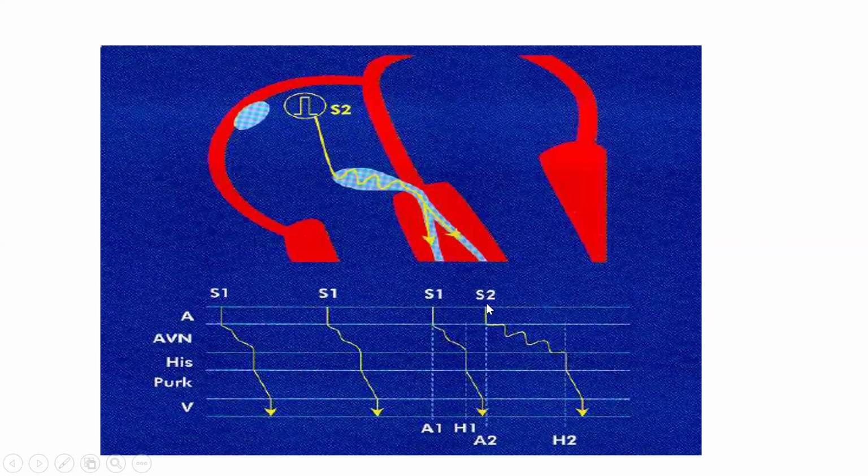And anytime they shift to a shorter duration of pacing, you call it A2, H2. If there is a V, V2. We're just trying to say use that terminology when you are pacing. The S1 means that you started pacing at a particular rate. If the duration is now shorter, you call it S2. If the duration is even shorter than S2, you call it S3, and like that.